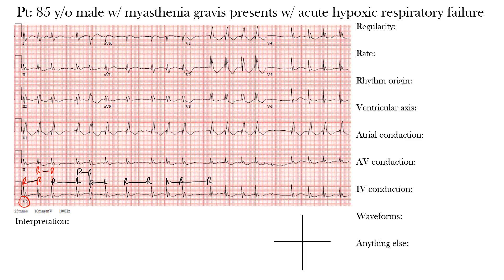Because there is no regularity to the R-to-R intervals whatsoever across the whole EKG, we call this an irregularly irregular rhythm.